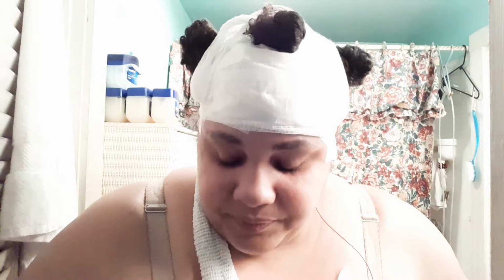You have to keep this with you at all times. You cannot take it off. It's with you for 72 hours until you go back to the doctor and they take it all off. I also have electrodes right here. I had to tape them down because they were falling. I don't know if you can see. I'm sorry. Yeah, there you go. You can see that now. See?